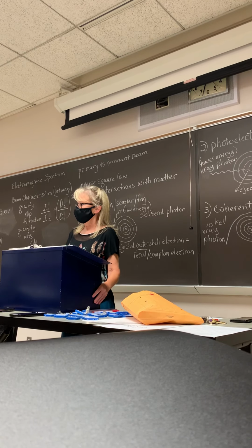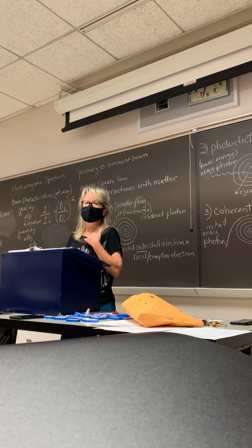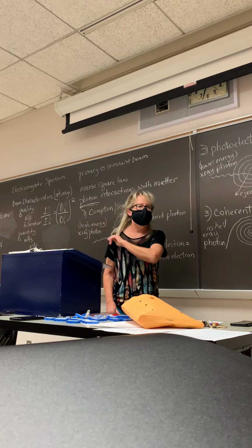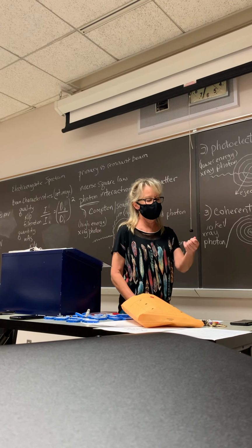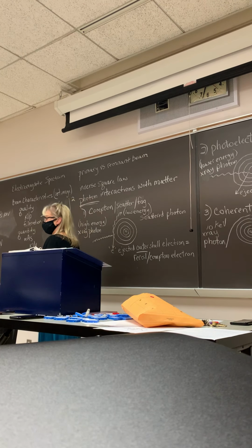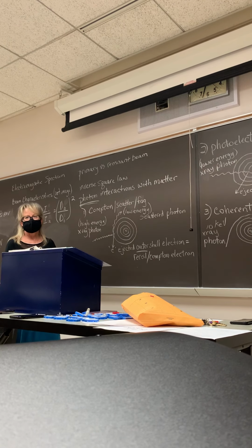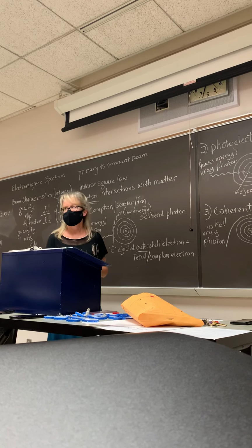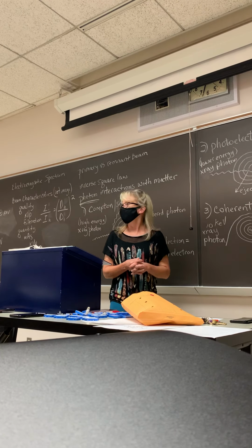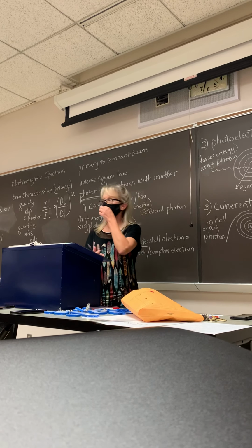Okay, types of filtration. There's two types of filtration. First one is known as inherent filtration. That just means it's already there. I don't like to say it's built in by the manufacturer, because actually added is built in by the manufacturer. So inherent filtration is just already there. It's part of the tube itself. So give me some examples of inherent filtration. Good, the glass envelope. Good, the oil bath that surrounds it. The tube housing.